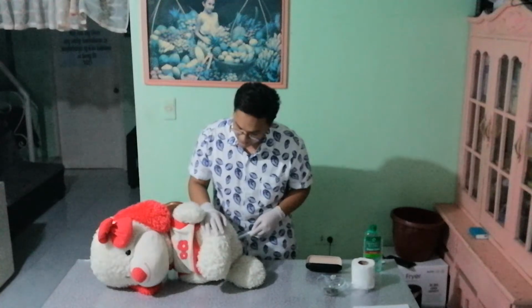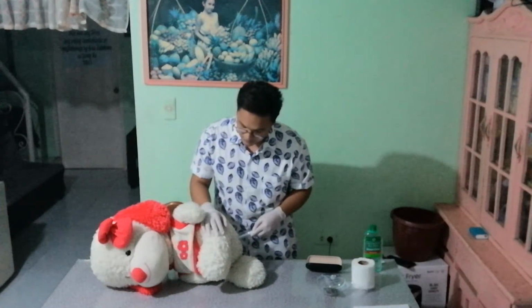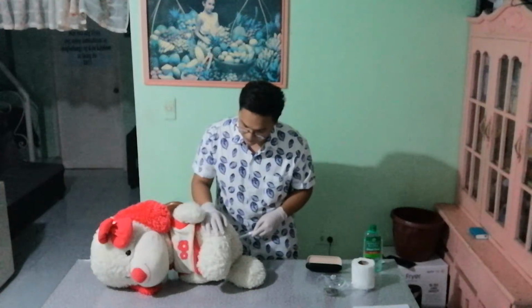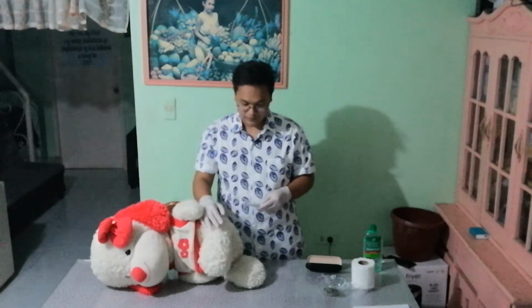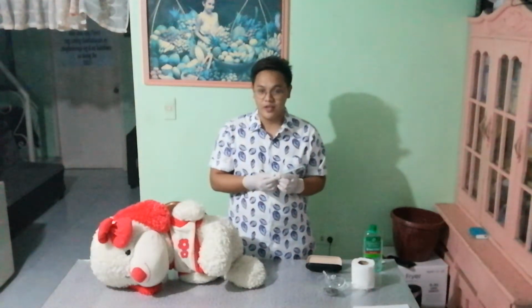You may feel again a little bit of discomfort, so please relax. After removing the thermometer, we need to note the temperature reading.